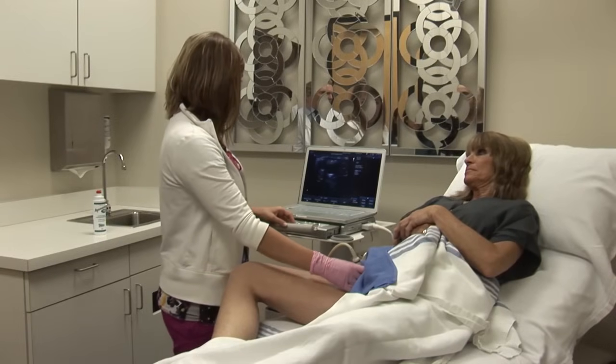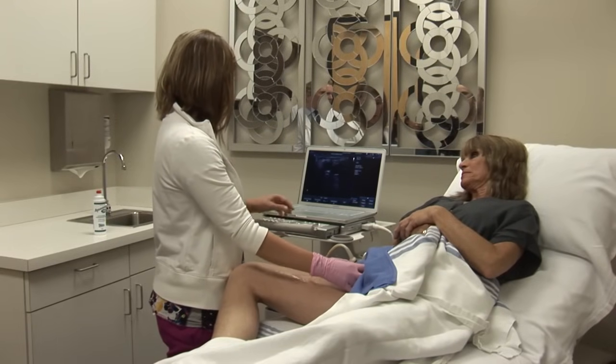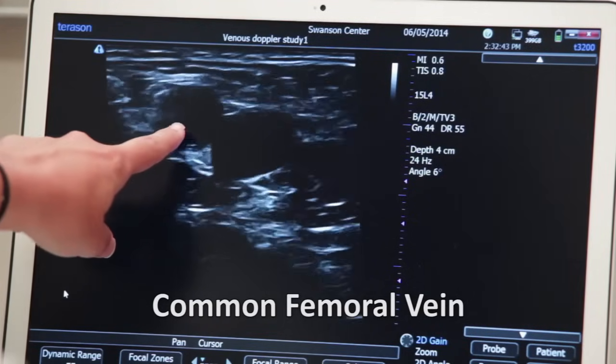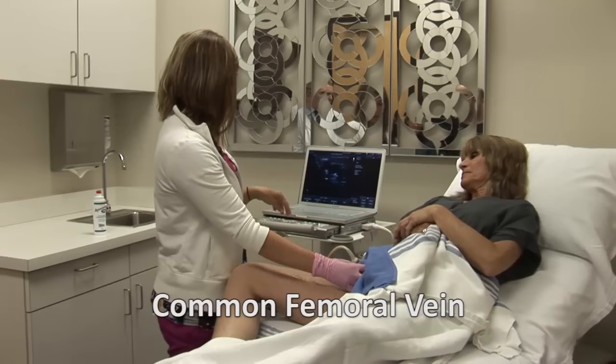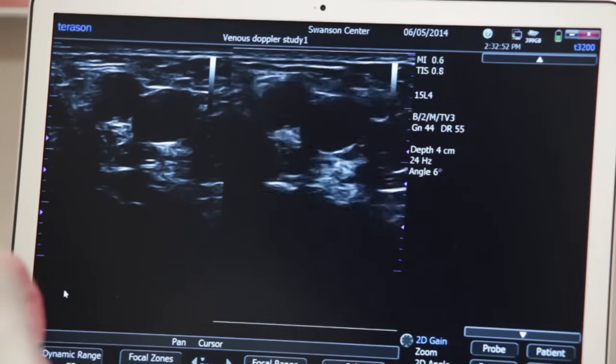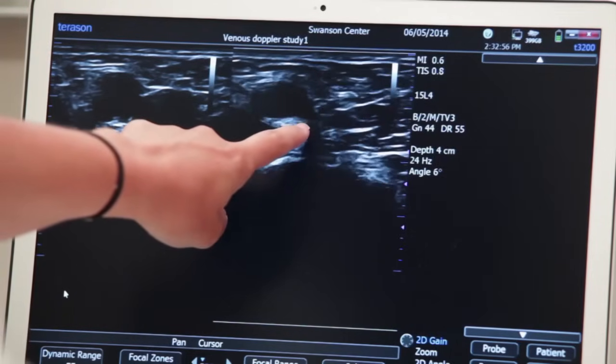When we check for deep vein thrombosis, or DVT, we start at the common femoral vein, which is right next to the common femoral artery at the proximal thigh. We first show that the vein compresses, demonstrating that there is no thrombus in the vein.